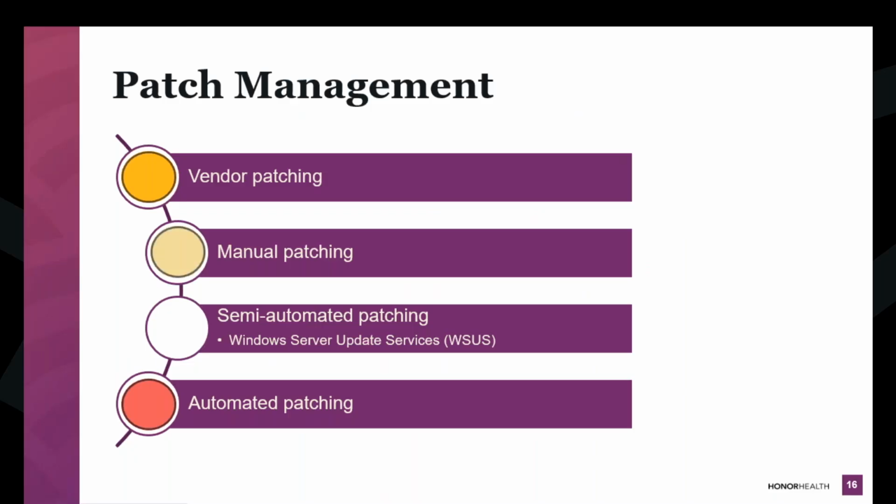Manual patching, like I said, if you have a solid program in place and your environments are comfortable with patching devices, this is a good option for you. It's better than automated patching, and it's better than vendor patching, in my opinion. And then, of course, my personal preference is semi-automated patching, where HTM has control over the patches that are installed on the device, and we deploy the patches when we are in front of the device. So it's a full HTM-controlled environment for patching.